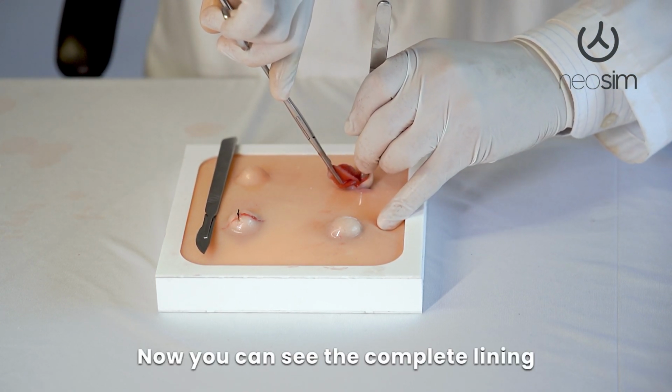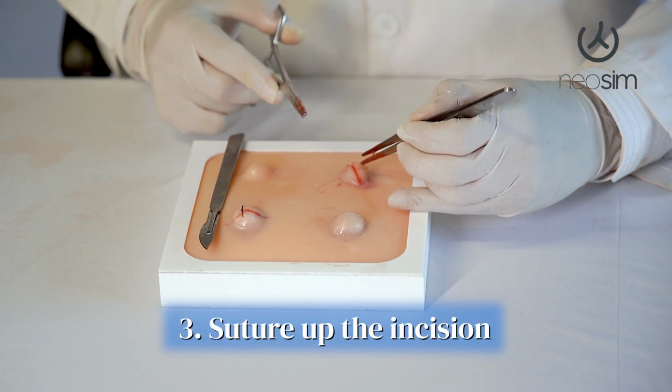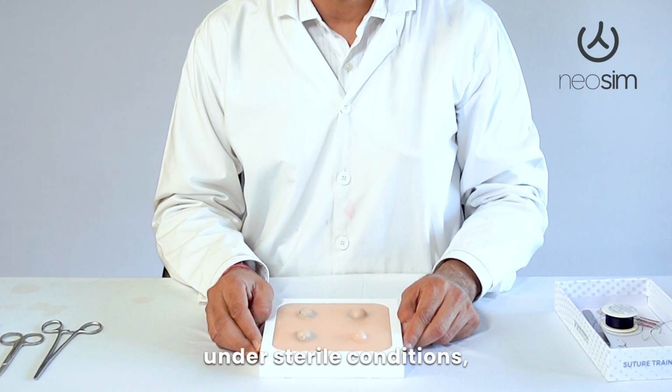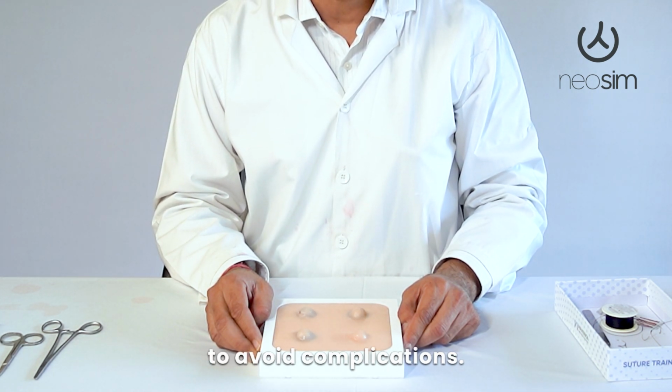Now you can see the complete lining of the cyst has come out, and then again, it has to be sutured. Remember, while these procedures can be done under sterile conditions, it's always better to consult with a medical professional to avoid complications.